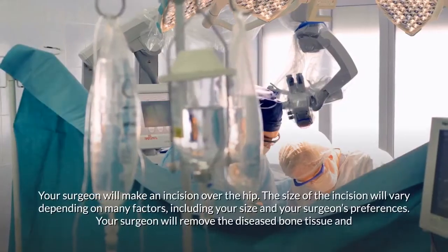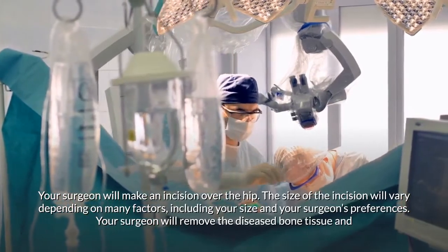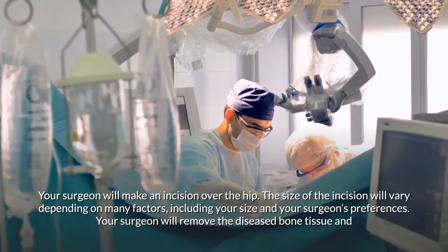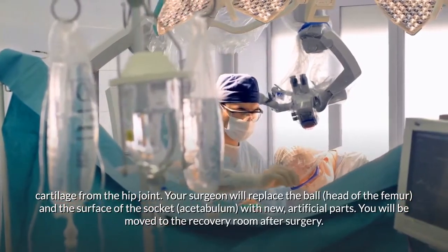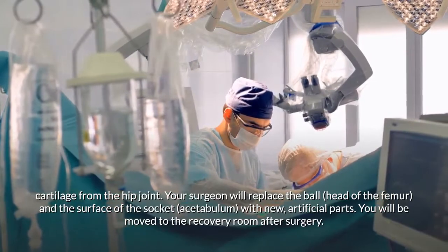Your surgeon will make an incision over the hip — the size of which will vary depending on your size and your surgeon's preferences. The surgeon will remove the diseased bone tissue and cartilage from the hip joint and replace the ball of the femur and the surface of the socket with new artificial parts.